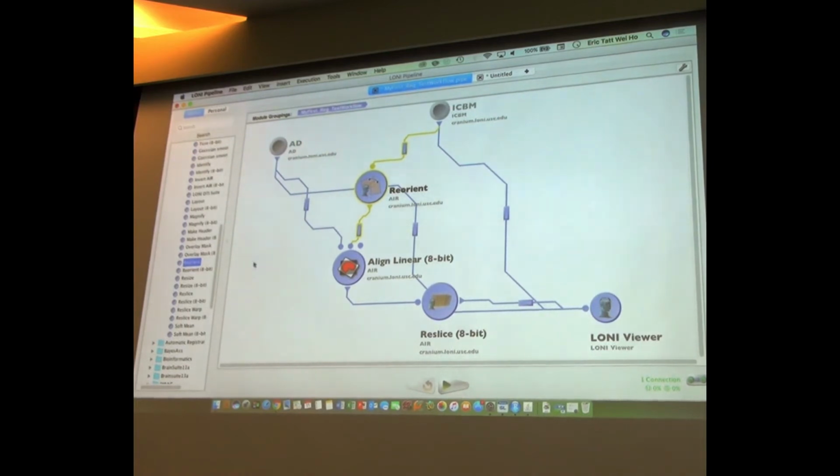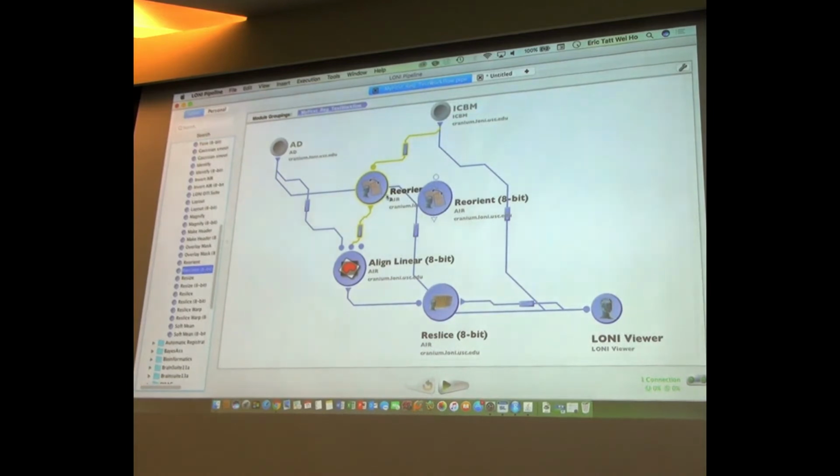Let me see, that may or may not be enough. Actually, hold on. Because I don't know exactly the metadata about these atlases, I may need to experiment a little bit. But this is actually good for you guys because you can see exactly how things happen in practice. Trial, error, revision, redesign, that's exactly how these workflows get generated.